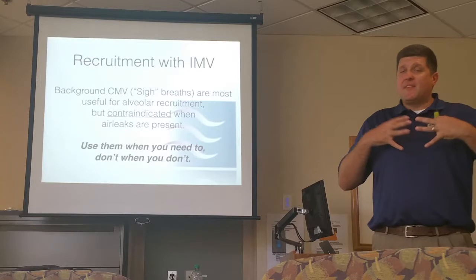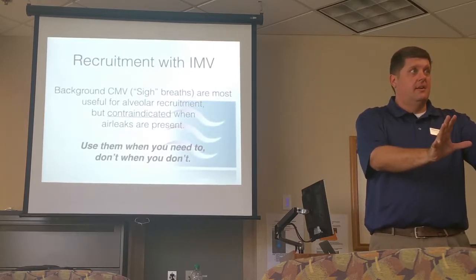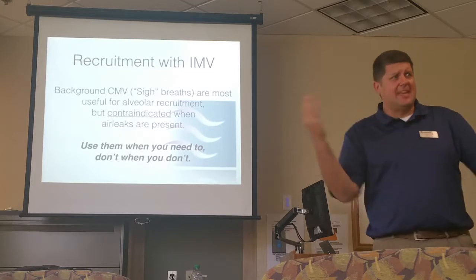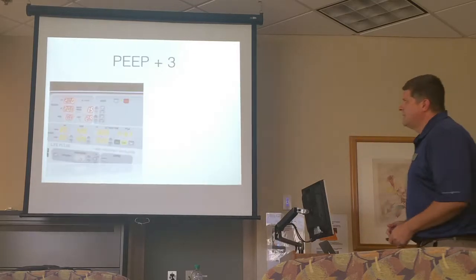I may have gas trapping on x-ray. I can dial in the jet to try to treat that. But what good is that strategy if I keep putting volumes in on top of the strategy that I'm trying to develop to get rid of it, to help treat the air leaks?